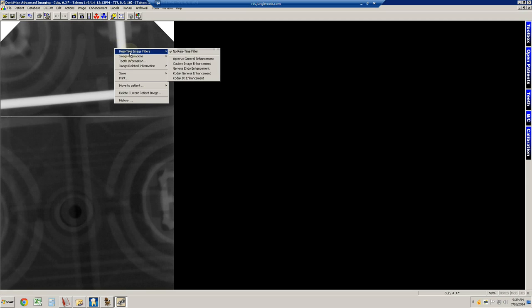You can do a number of different things with this. You can right mouse click, and there are filters that you can use. Typically, the no real-time filter is what's selected. Apteryx General Enhancement Filter, it goes through, and you can see how the image got a bit more grainy. If you go back and switch from Apteryx General Enhancement Filter to no filter, you see it gets fuzzy again. It just depends. Dr. Culp will determine which setting is appropriate for each image.